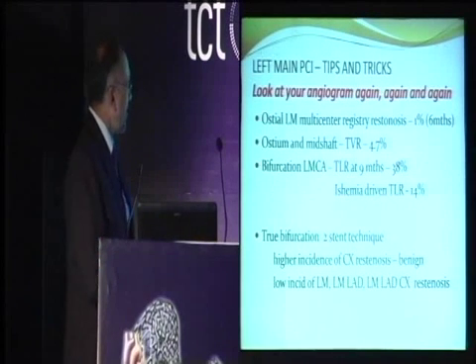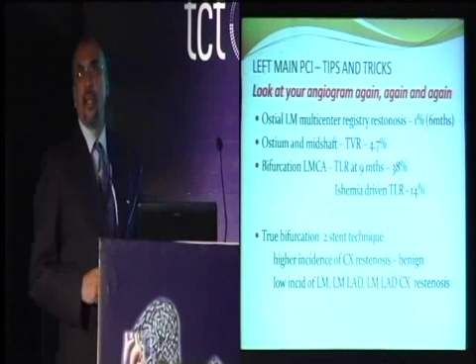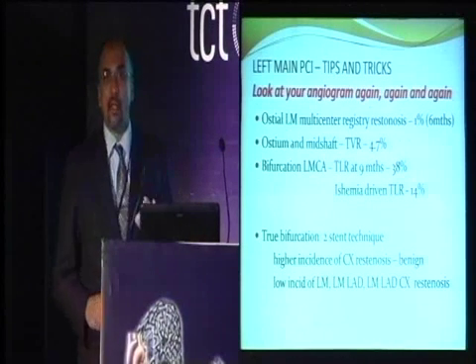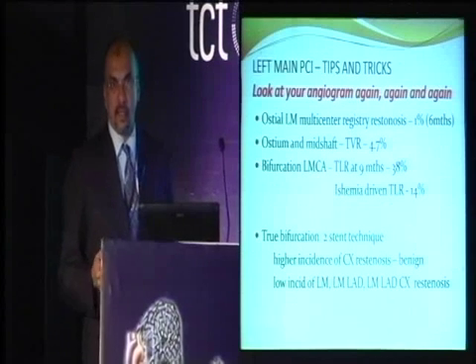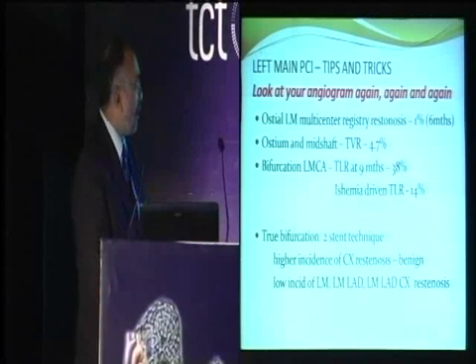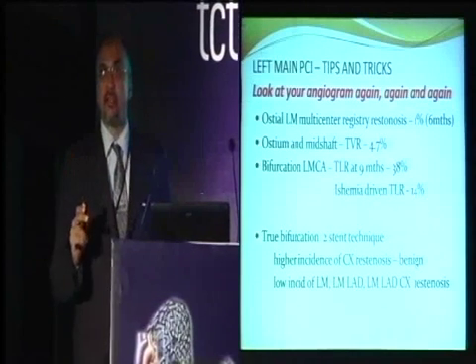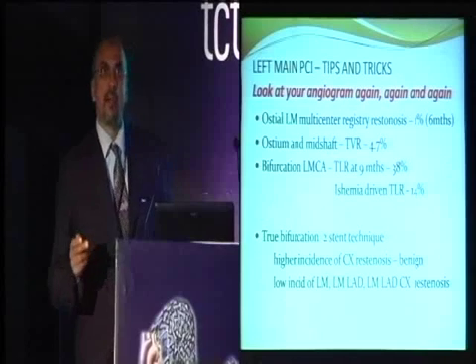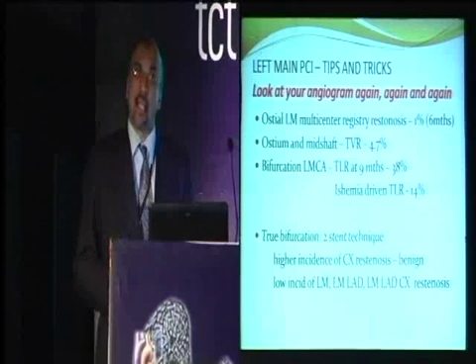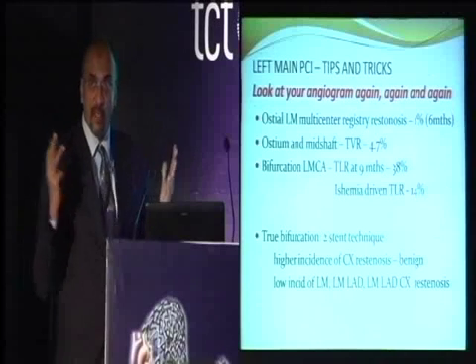Why so? If you look at the ostial left main multicenter registry, the restenosis following a left main ostial angioplasty at the end of 6 months is very low. It is 1%. I mean, this is something that is God sent. Imagine having a left main angioplasty done with a risk of restenosis of 1%. I agree this is 6 months, but what is very clear is left main ostial angioplasty restenosis is very less, because most of the time the ostium is more fibrotic and not much calcific, and therefore restenosis is less, because these come in from the aorta.